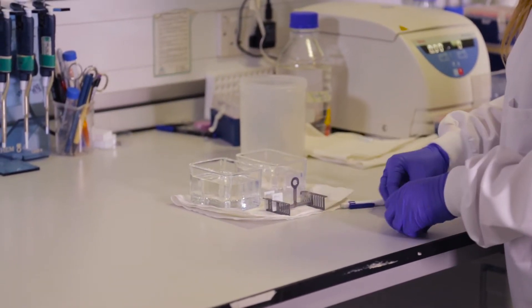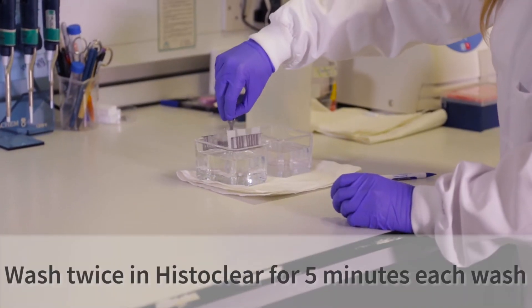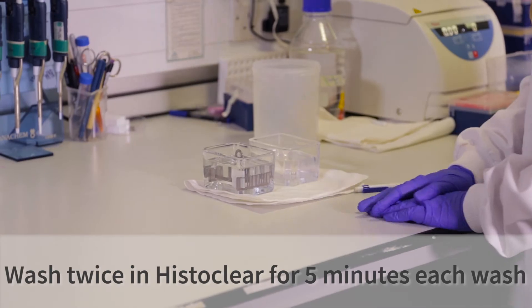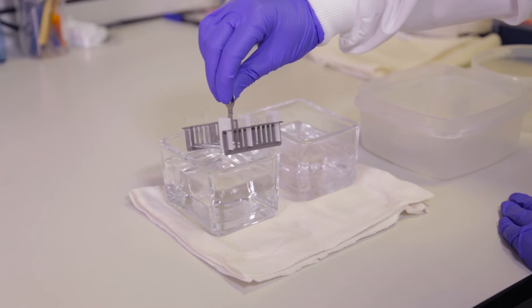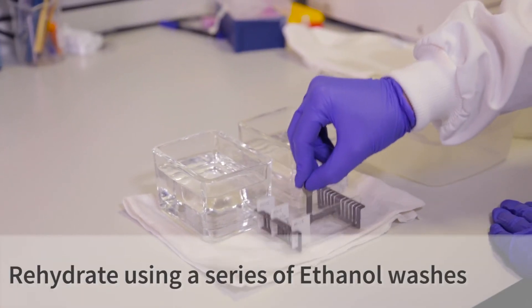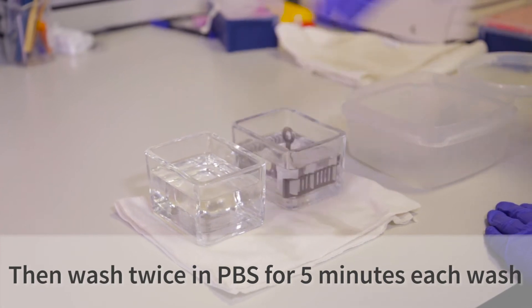We begin the procedure by clearing the paraffin from the sections by placing the slides in histoclear. All washes in this protocol are done using glass cuvettes and a slide rack. After two histoclear washes, we then begin an ethanol hydration series, going from 100% ethanol down to water through a series of washes.